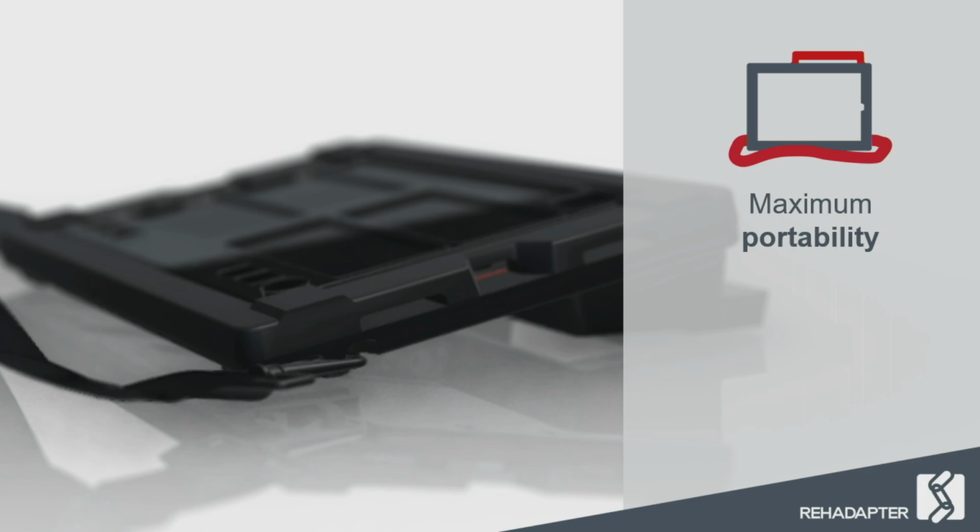Let's talk about the maximum portability. We know that a lot of our customers are mobile and want to be flexible enough to carry the device. So we thought it might be a good idea to integrate an innovative shoulder strap system. That means, as an accessory, it is possible to integrate a shoulder strap in combination with the Rehadapter, and these shoulder straps can easily be clicked on these 2 discs at the Rehadapter, like this, to carry it when a mobile user wants to transport it on a daily basis.